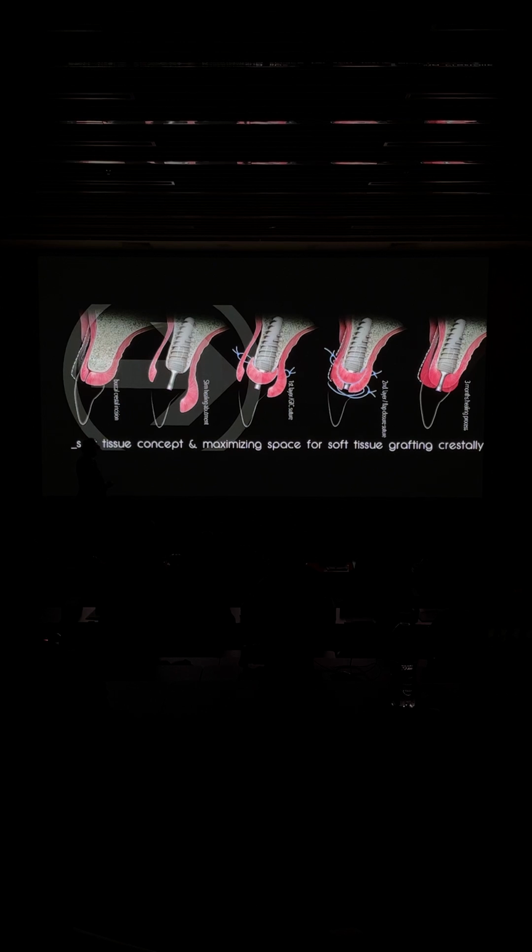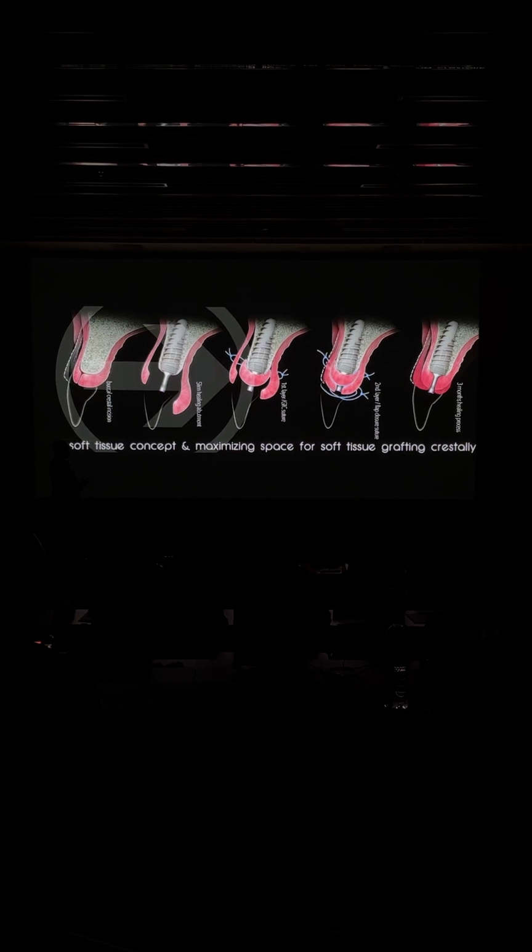So the beauty of having this slim healing abutment is it acts as a bond, so the tissue won't move, and it's easier for you to come outside of your flap, taking the connective tissue, getting out, and suture. So the soft tissue is stable on the crest, and then you suture it on top of it. We only maintain this abutment 3 months. Why is that?